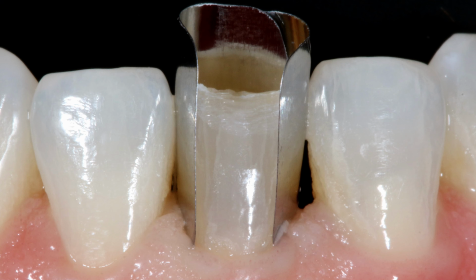These are just two bands, and you can really see the curvature of these bands in this photo, which is really nice. You can also see how well they're tucking into the sulcus here. That's the first thing I noticed when you sent us this: boy, they tuck right in. They do. For this case I didn't necessarily need a great seal down here, but anytime you can get that, that's what you want, especially for restorations where you're prepping down here. But for this one, I had two matrices at the same time.